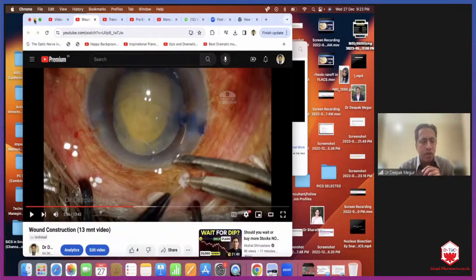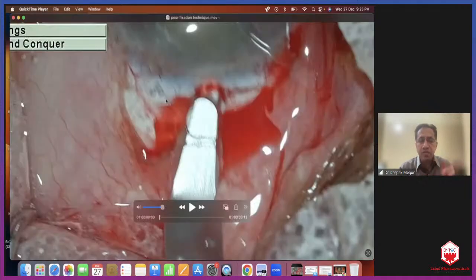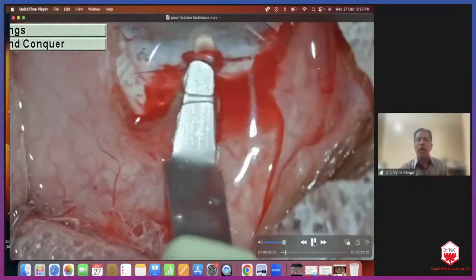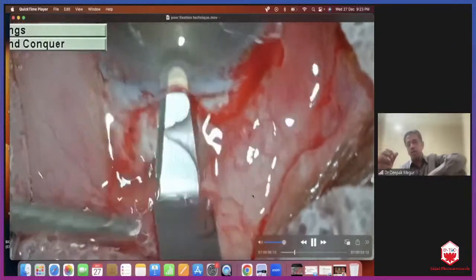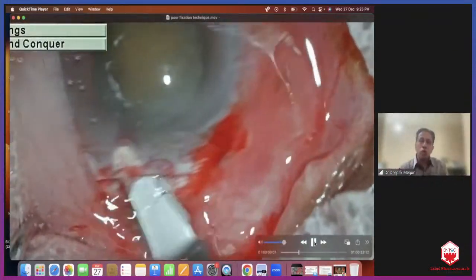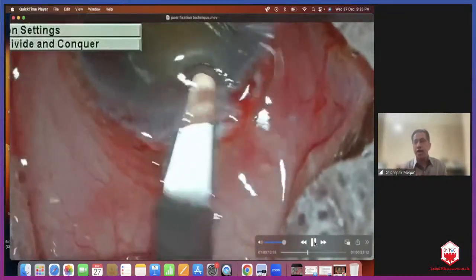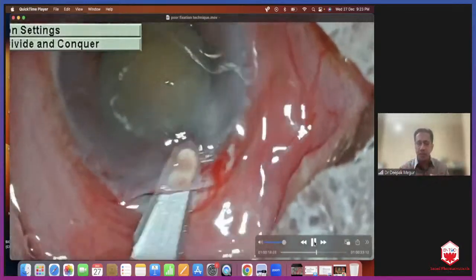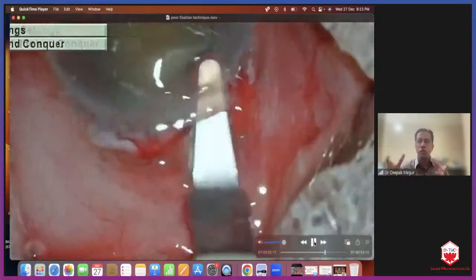Another very common difficulty which most beginner surgeons have is the way they fix the globe, the way they hold it, because probably they were not taught well. You can see the surgeon trying to fixate at the inferior limbus. That's also a good idea. But the globe is moving so much that, in spite of having a very new blade, you can't cut across it because the globe is moving everywhere. So some basic aspects, like having good fixation, are something which we need to teach these people.